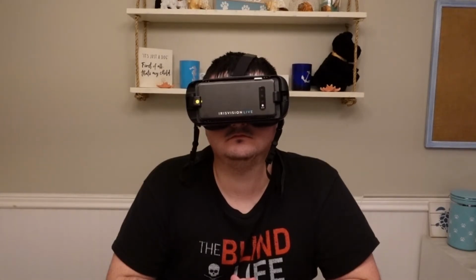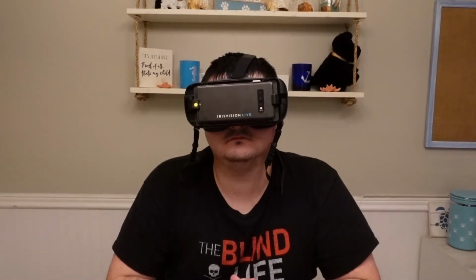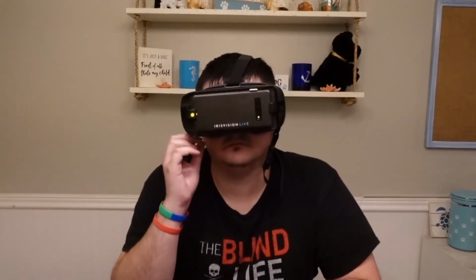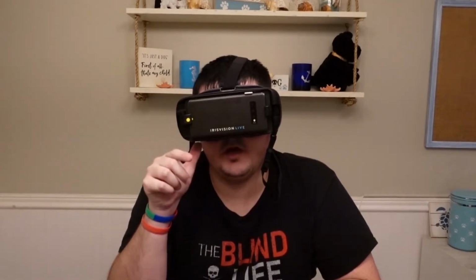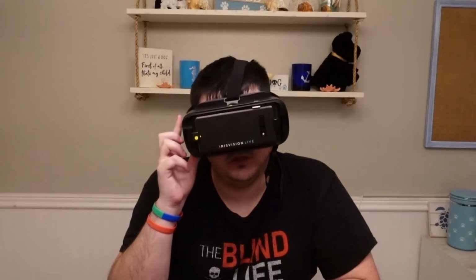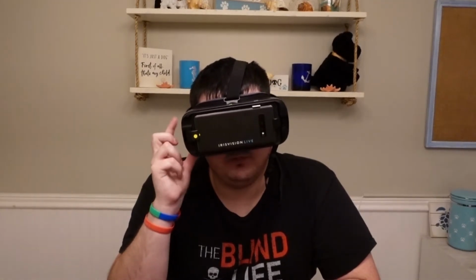It will appear in full screen view, and then magnify the selected photo by swiping away from you or by swiping up. So it's away or up. Decrease magnification by doing the opposite, down or towards you. Yes. So down, towards me; up, away.